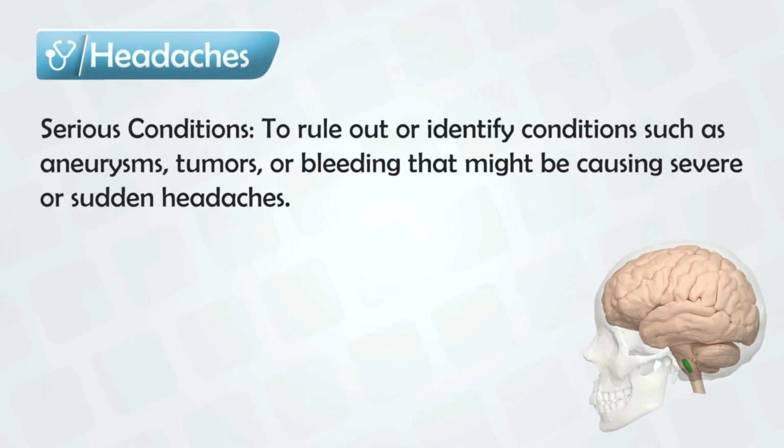And sometimes if a patient had sudden severe headache that they have never had before, or the headache is so severe that it does not respond to conventional analgesia, CT can be done to rule out the severe or serious conditions that can cause headache, like intracranial hemorrhage.